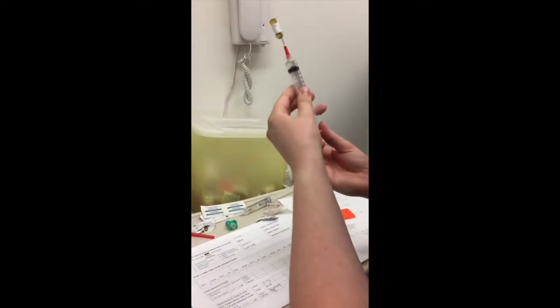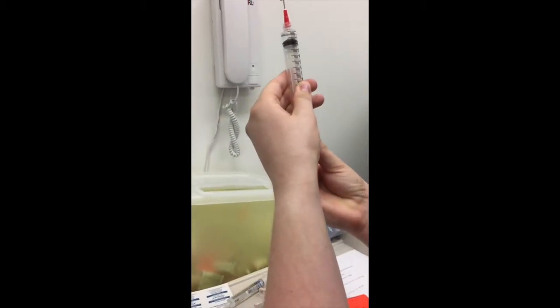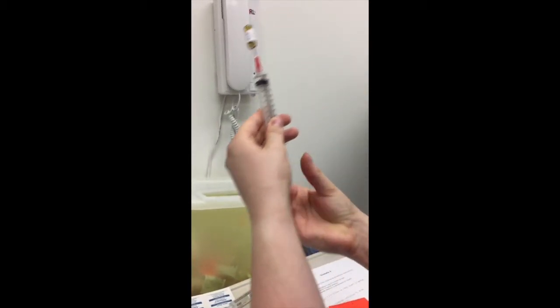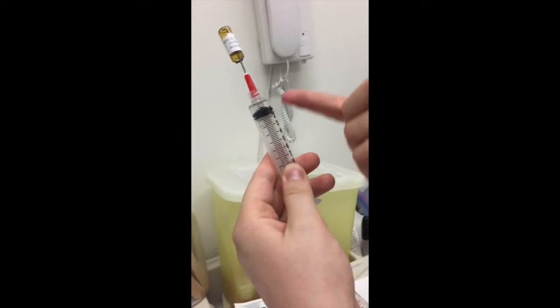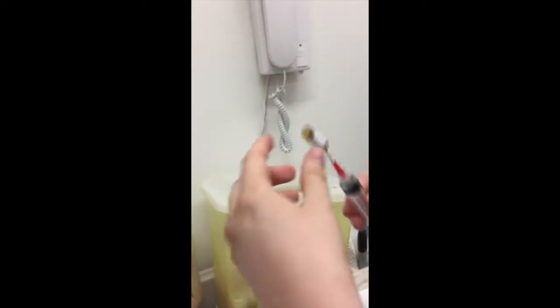All right, Sarah, let me just quickly get the bubbles out. Sarah, I've taken out my entire 1 ml from this dose. You can see right here, it's all in there.